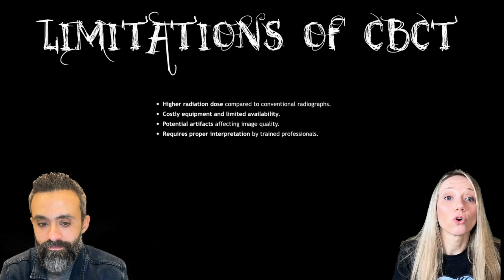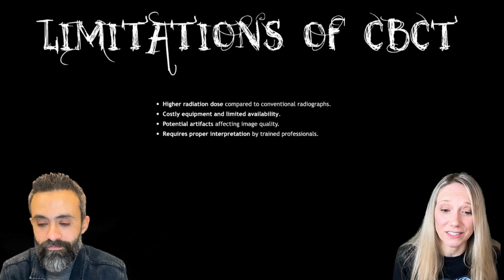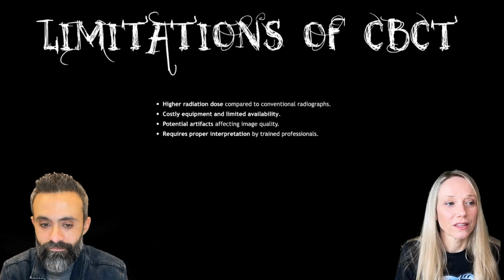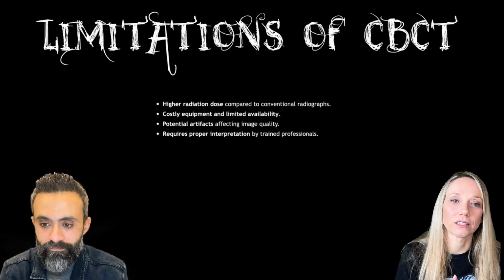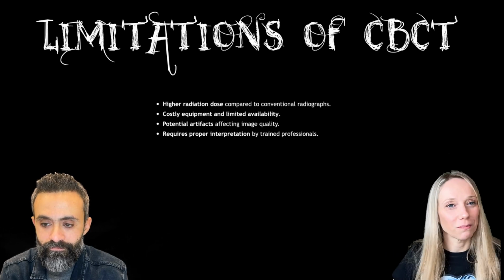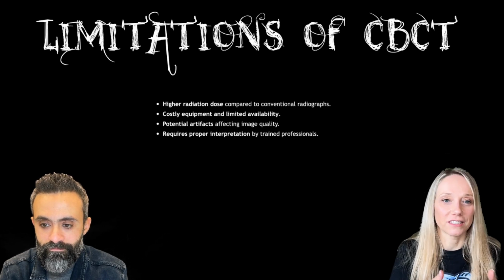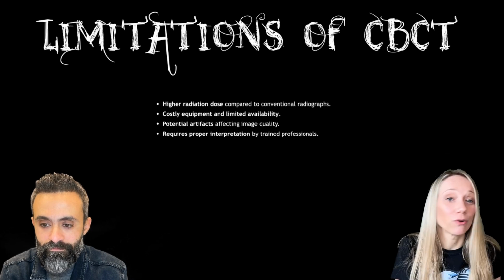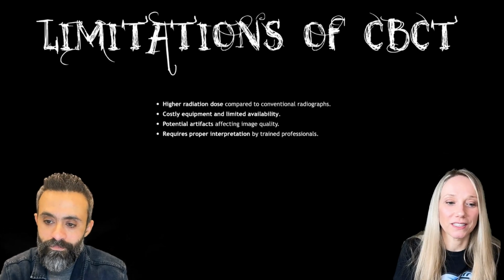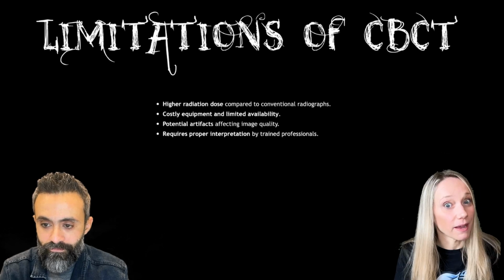And of course, if you want to have a CBCT in your practice, it costs. It costs you money. It's expensive, and so it can be a problem. But if I have the CBCT in my practice and I have a problem, I take the CBCT, watch it immediately, and solve the problem with the patient immediately. Otherwise, I see the patient, I have to send him outside or elsewhere for a CBCT, then I reschedule the appointment and discuss with him, etc. So it's about ergonomics. It's an investment that one can make, and it might be worth it.